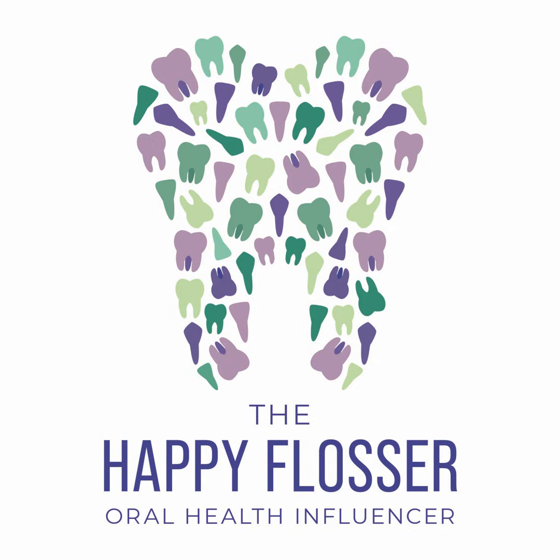And then I will look and scan specifically for horizontal bone loss throughout the two arches. And then I'll tend to hone in on specifics of triangulation or vertical bone loss. And the last thing I check, I don't know why, is furcation involvement and calculus deposits. Although as a hygienist, we all know that the calculus is what gets us excited. So if there's calculus on a radiograph, that tends to be the first thing our eye goes to. I try to force myself to not get too excited about that and kind of hold off until after I've assessed the periodontal structures.